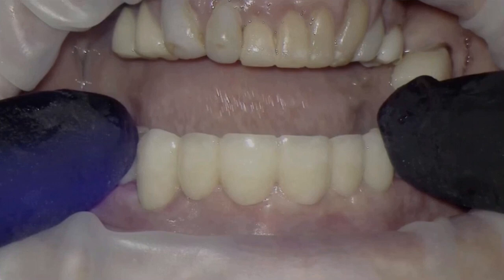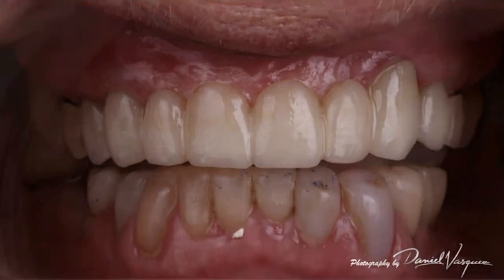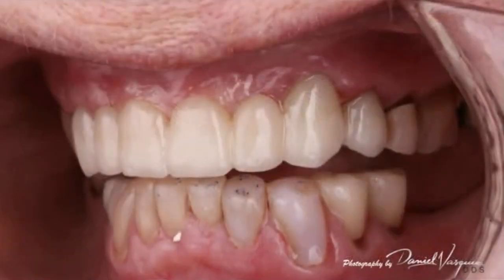Now, sorry, this is only a temporary. This is not a permanent. We're going to be using a full one piece zirconia, okay, for the final restoration in this case. This is how it looks after it's been cemented. A couple of photos in there, and you can see how beautiful it looks. I can do this every day.